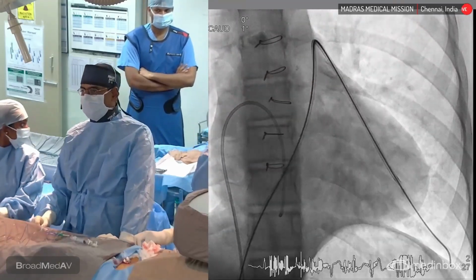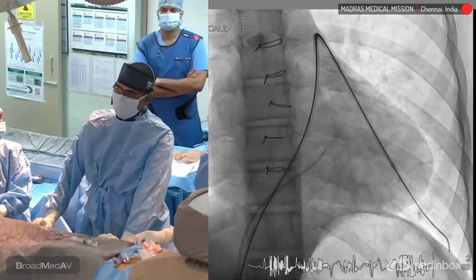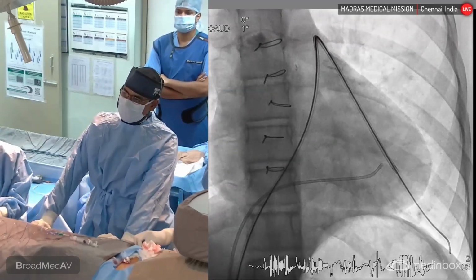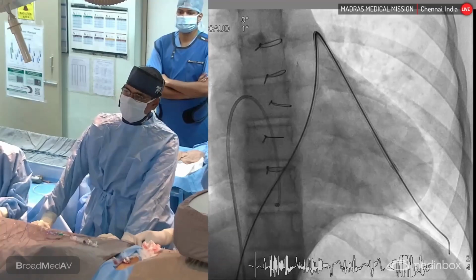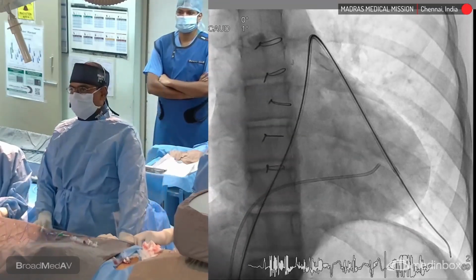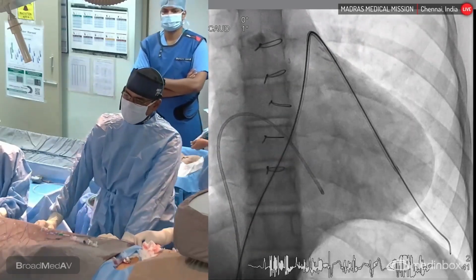And then the next picture. From here, we advanced the catheter into the left pulmonary artery, and we parked an Amplatz superstiff guide wire. The distal left pulmonary artery pressure is 25 millimeters of mercury, thereby giving a gradient across the outflow tract of close to 75 millimeters of mercury.